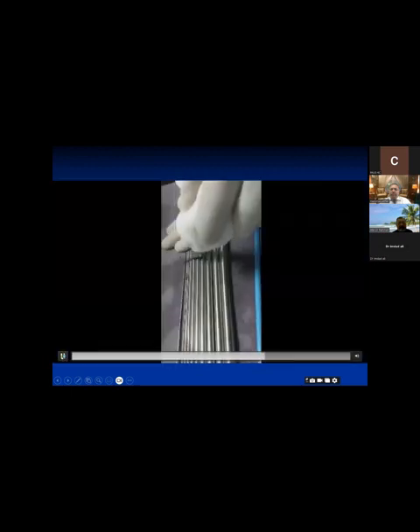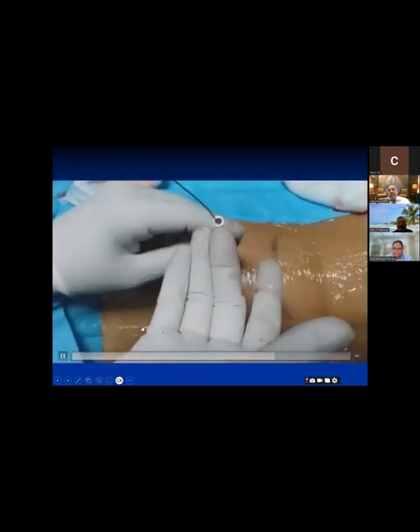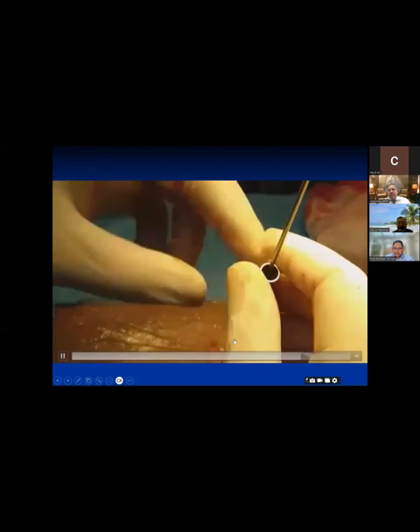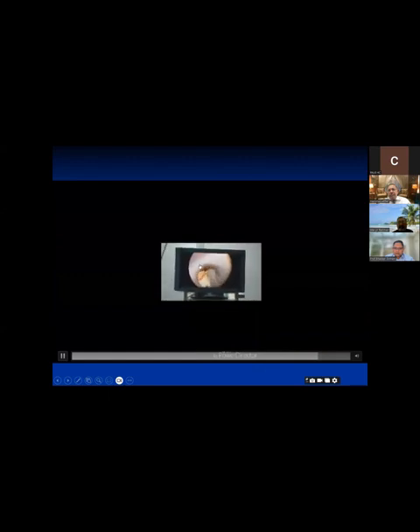I'll just show you one thing. What I do is, for example, if the needle has gone in 5 centimeters, I mark all the dilators at 5 centimeters, and then we don't go beyond 5 centimeters. As we all know, during ultrasound you cannot guide your dilators. So this is the mark where the dilator stops. And one assistant is continually pushing the water through the ureteric catheter. This is the end of the procedure.